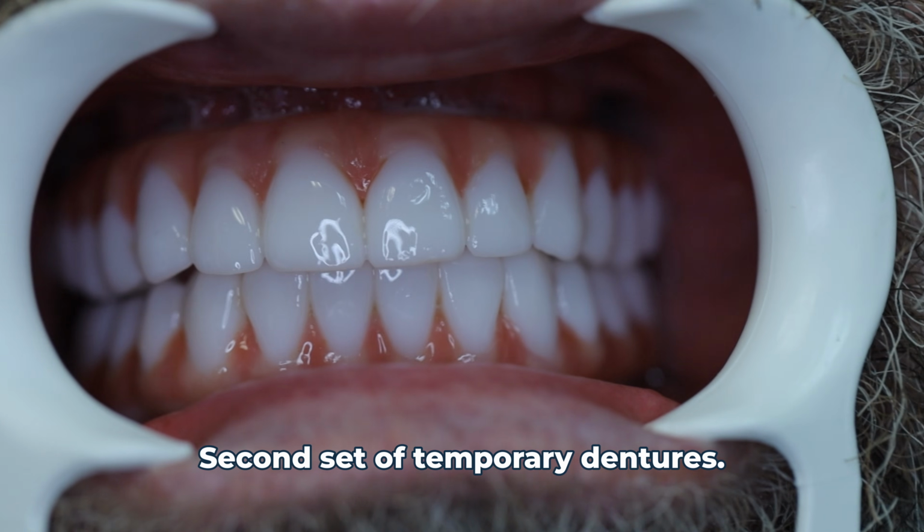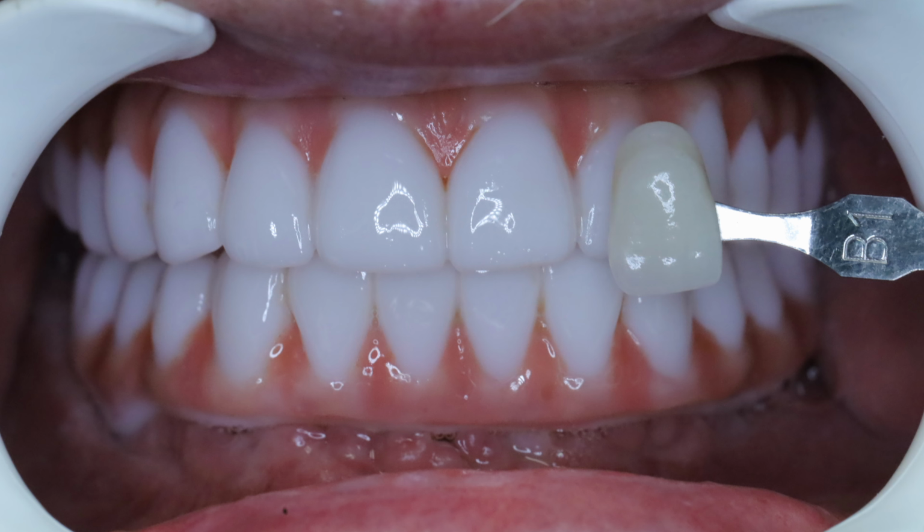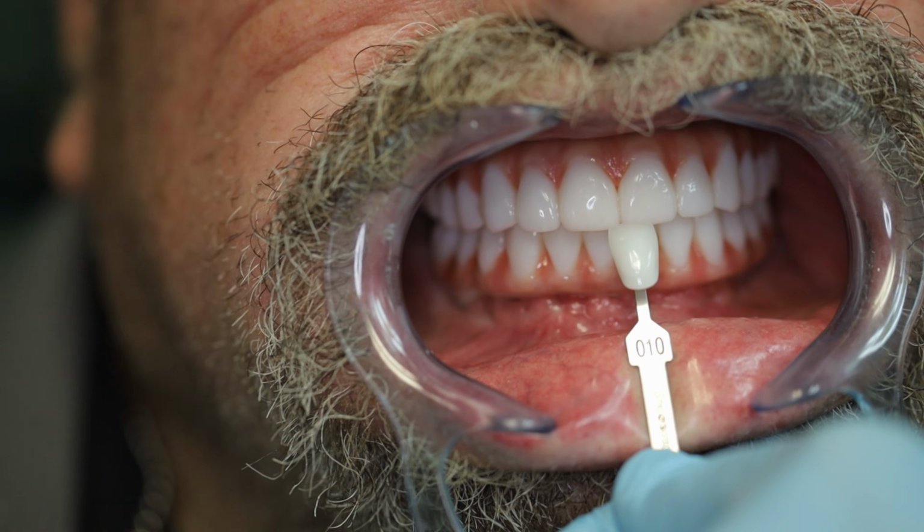Still, we confirm that it's perfect, but even if it weren't perfect, we can still adjust the bite of these new provisional dentures. Here, we make the teeth wider than what we think they are going to like, and we will bring down those upper teeth more than we think that we actually are going to do, so we can see how all this looks.